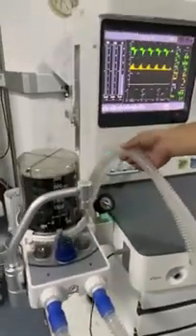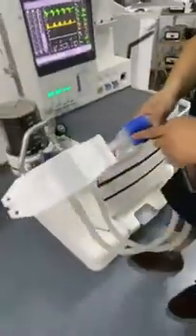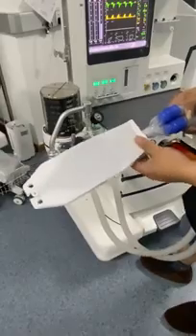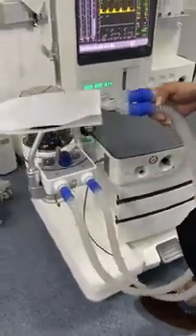At the end of the two pipelines, we use a Y connector to combine them. And then finally we connect the test lung. So all of the connections will be finished. When you are using it during the operation for the patient, we just take out the test lung and connect the mask. Or maybe you can also do the intubation.